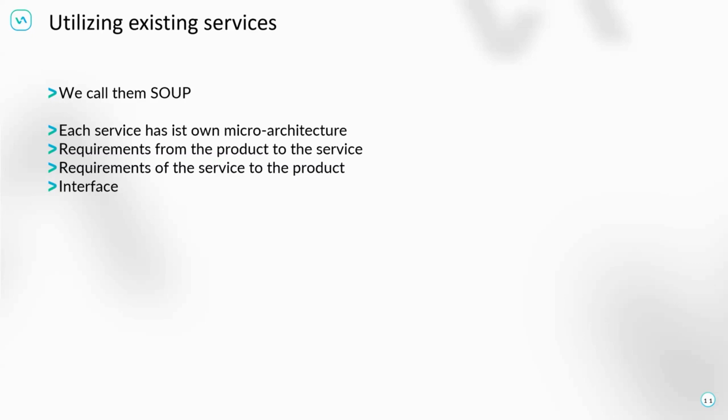And what is very important for each of those services, you need to look for issues in the post-market surveillance system. So looking into the future after release and as part of the software maintenance, you need to control, as for each medical device, the framework, how it is being created and built.